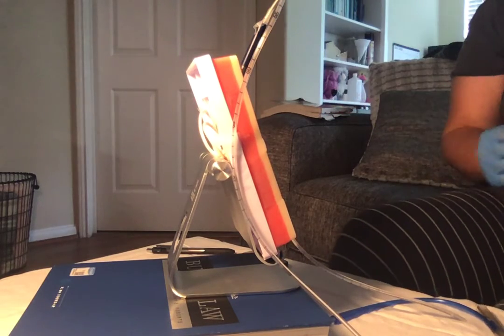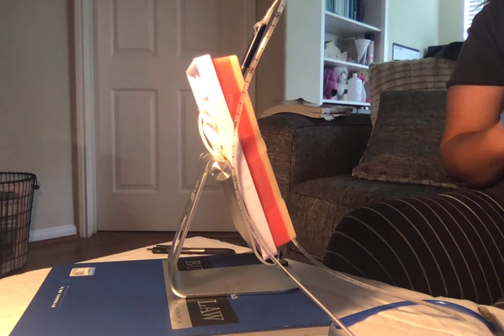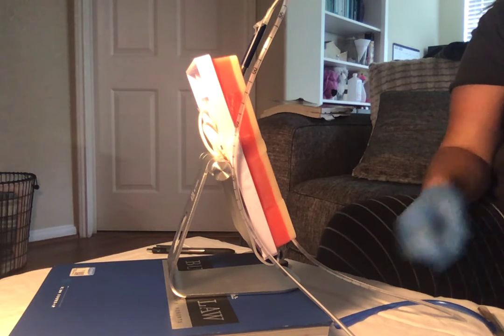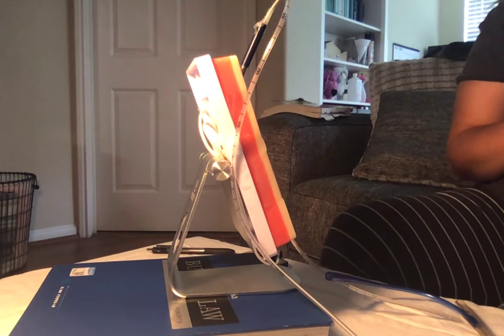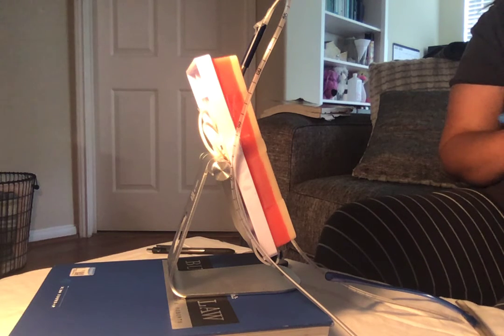We will fasten the end of the NG tube to the patient's gown using a clip or piece of tape. I'm going to keep the head of the bed elevated at least 30 degrees unless otherwise ordered, and attach the NG tube suction to the suction source and establish suction low intermittent setting unless otherwise ordered. I'm going to provide oral hygiene every 2 to 3 hours. I'm going to assess the patient's comfort level.